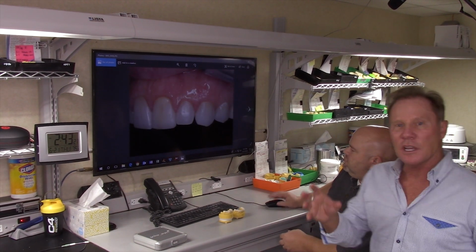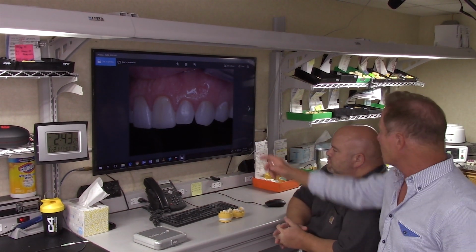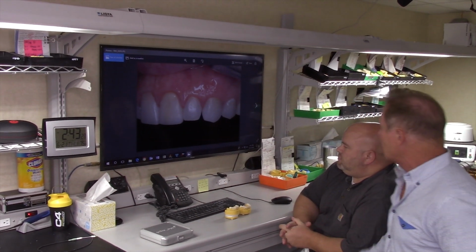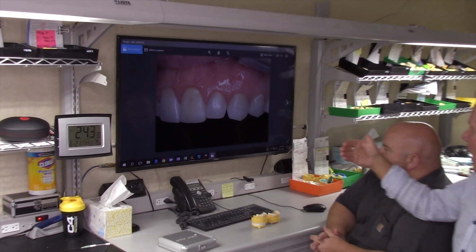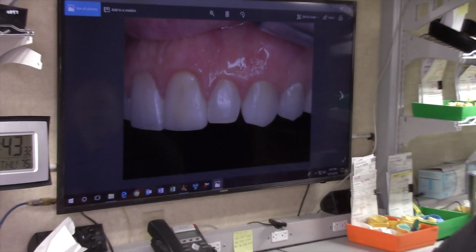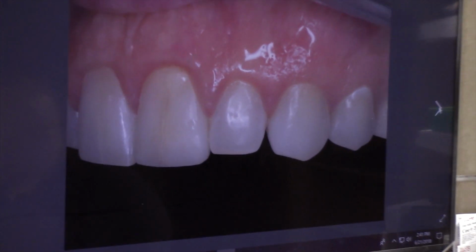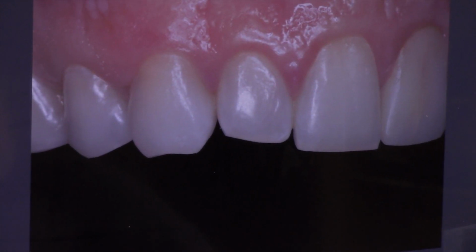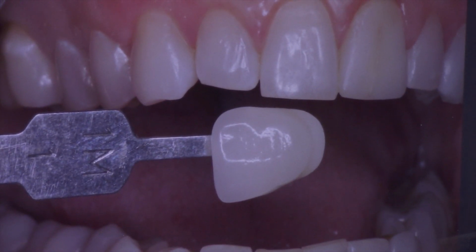One of the things we see with especially a ring flash is we see the shiny parts of the teeth, the reflective parts of the teeth. The flash rebounds and it kind of distorts surface texture and some subtleties. And so go a couple pictures further. I want to talk a little bit about a polarizing filter. Let's stay there for a minute first.